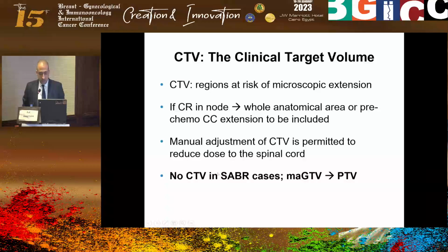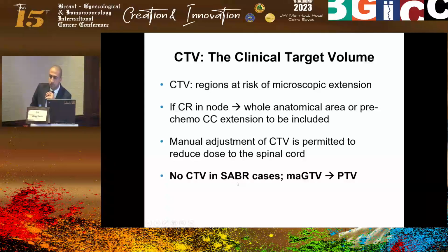So just also another issue is that you can, yes, please. Of course, we can use the PET, and if you have sequential chemoradiotherapy, sometimes you do PET after chemotherapy, and it sometimes is very useful. But we are talking about the situation where the tumor completely responds. You mean to fuse with the previous images? With the initial. You could potentially.